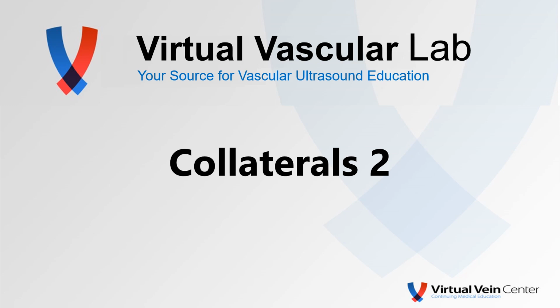Technical Tip Tuesday. I actually had a different case ready for you, but I came across this interesting case yesterday that in all my years of scanning, I don't think I've actually seen this to this degree. A couple weeks ago, I talked to you about the importance of collaterals in lower extremity arteries. This is collaterals 2.